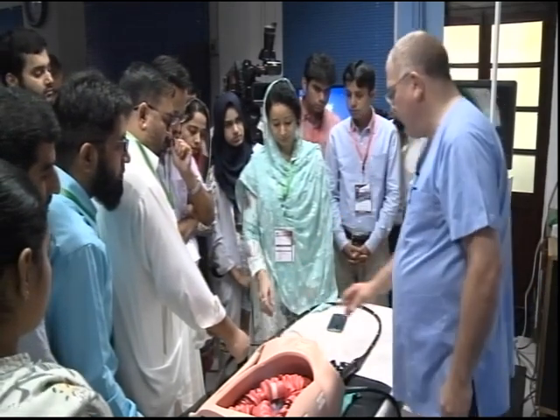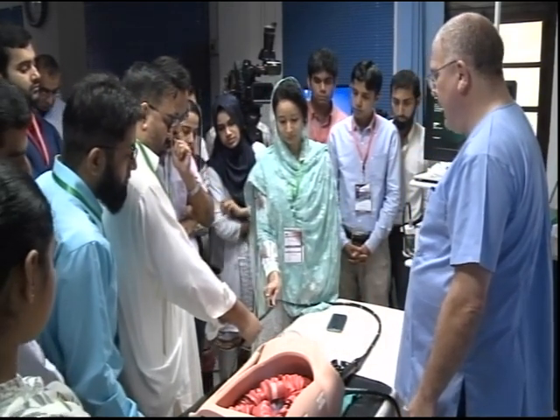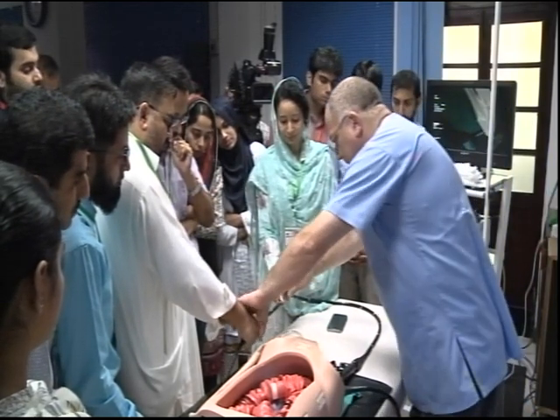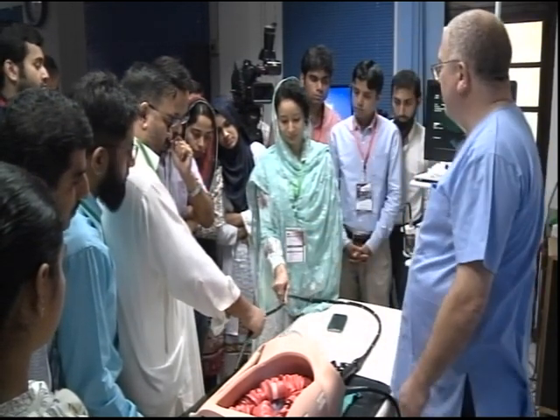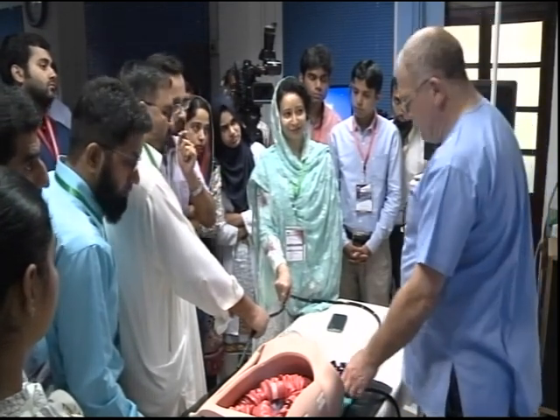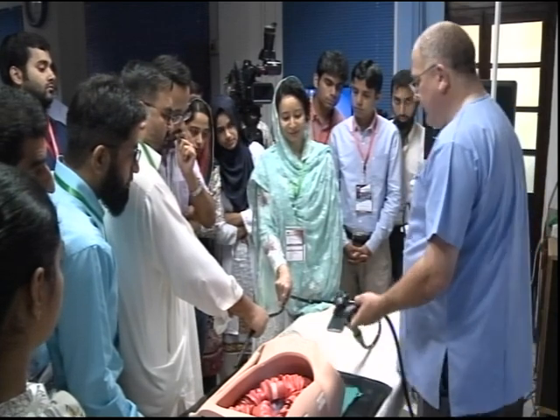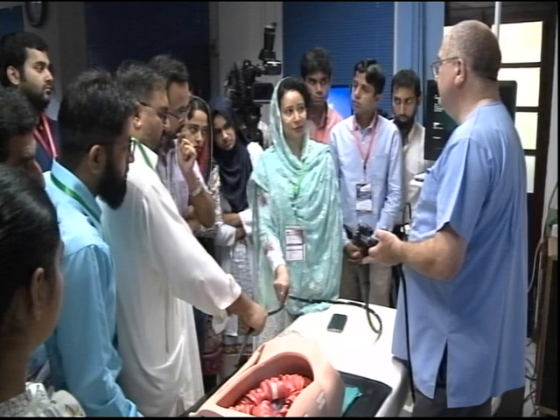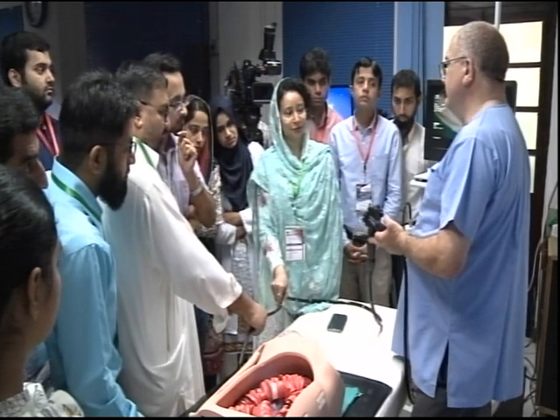So, yeah, try again. Anti-clockwise. Again, keep it in a straight line. To there, keep it going. How does that feel? Rigid. Keep it on. Keep it on. How does it feel? Now getting relaxed. How does it feel? A little bit stiff. How does it feel? Stiff.